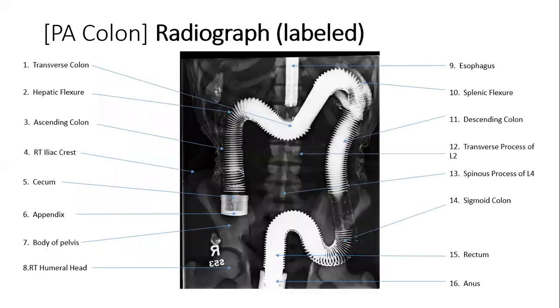The anatomy demonstrated in the image would be the entire large intestine, including the left colic flexure. The items in profile will include the large intestine and both the hepatic and the splenic flexure. The pathology best demonstrated in this image would be obstructions such as ileus, volvulus, and intussusception. That would include how to position our patient for a PA colon or a PA barium enema.